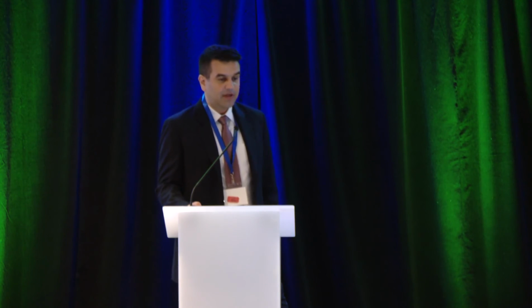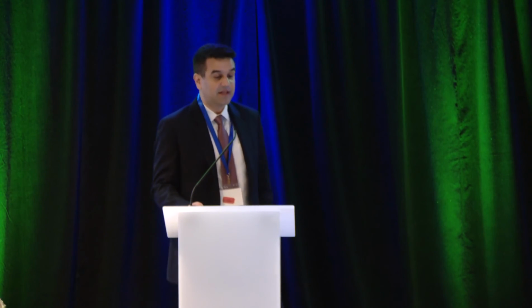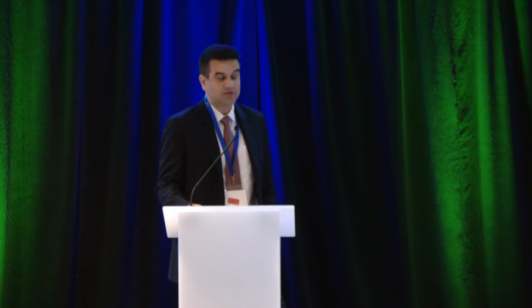Now, moving along, if you do not have an abnormal median IRP and you do have 100% failed peristalsis, you now have a diagnosis of absent contractility. And a conclusive diagnosis means that you have a normal median IRP in both positions and 100% failed peristalsis with a DCI less than 100.